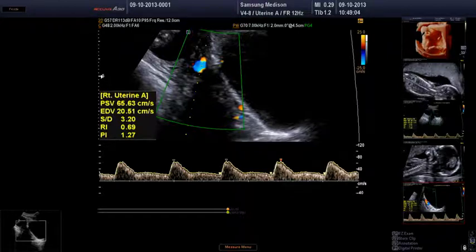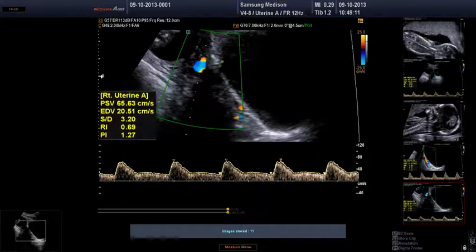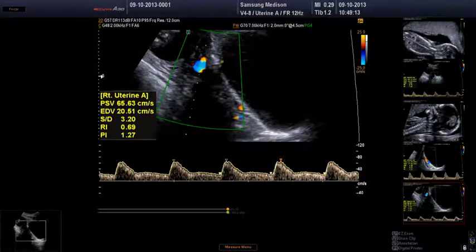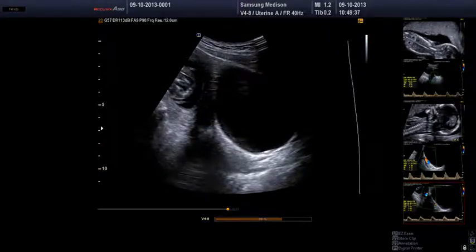So you can see as we've come more peripherally, the PI perhaps hasn't changed significantly, but certainly our PSV's much lower. And you do certainly see an increase in PI as you move away towards arcuate vessels. So it's really quite important to make sure that you pick up this vessel at the level of the internal cervical os. You're on to the last minute, John. Are there any questions from the audience of things that they want to see that they haven't seen yet, or any comments quickly while John's got the probe in hand?